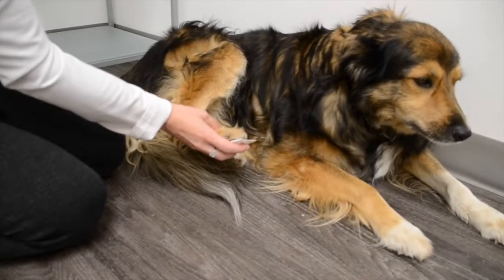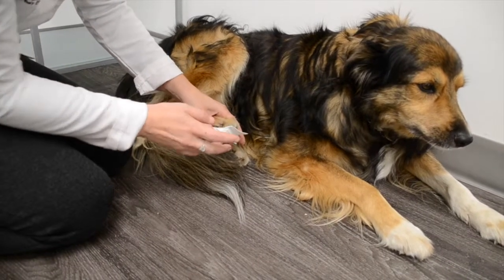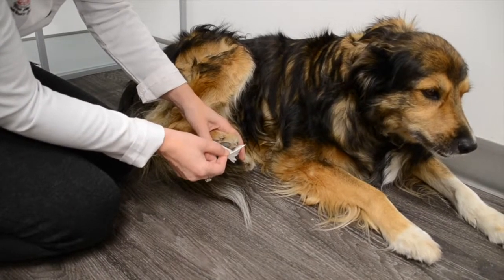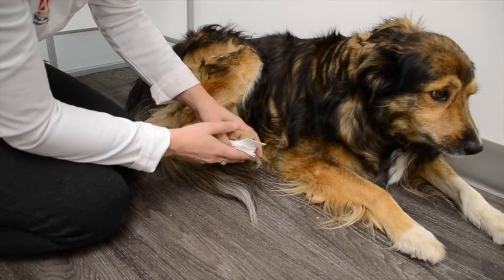Let's say, hey, you know what? It's actually bleeding pretty good. I'm going to want some gauze on there, so I'm just going to put it on the other side, like that, okay? And we're just going to have that, so we have a little extra absorbency, but that sterile portion of the bandage that's not going to really stick to the wound and reopen it when we take it off, that we want to always make sure is on contact.